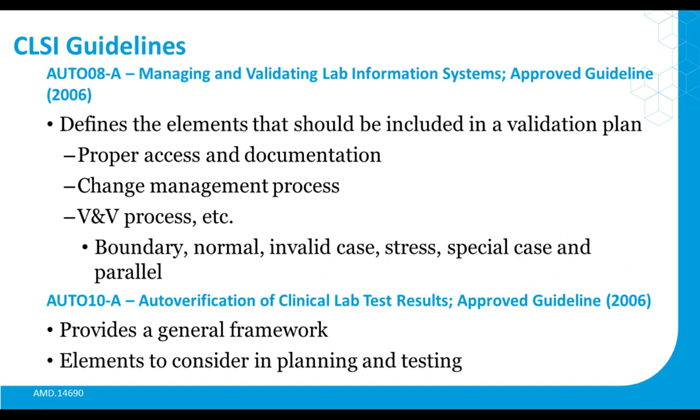And certainly the vendors of these systems are well aware and can help you with putting together a really good validation program. But these are two of the guidelines that I think are probably the most specific and offer the most specific guidance and use the nomenclature and verbiage and approach that any inspector would want to see.